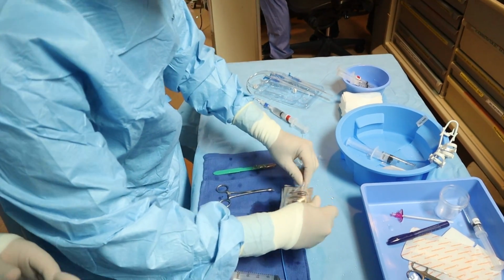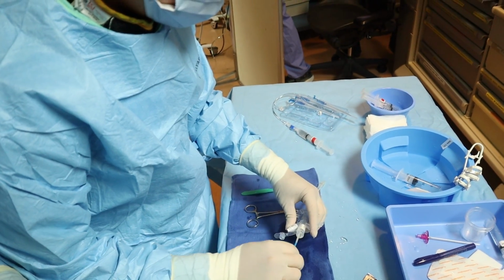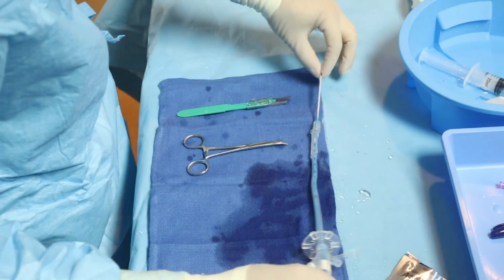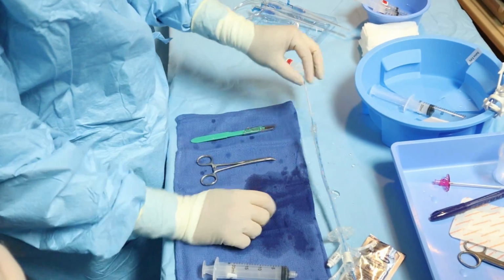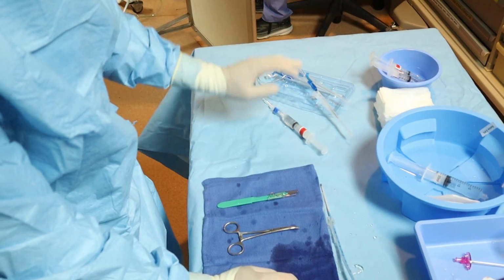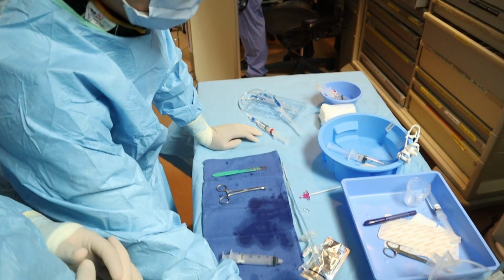Then you're going to load this non-compliant balloon, 8mm by 4cm, right through the tube. So it's coaxially loaded. The balloon will insufflate to 8 millimeters in diameter, and then this 18 French G-tube will go right over it. We have the 3 T-tacks, the 18 gauge open entry needle, and the insufflator ready.